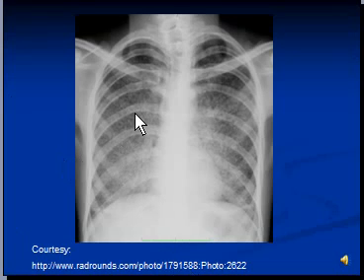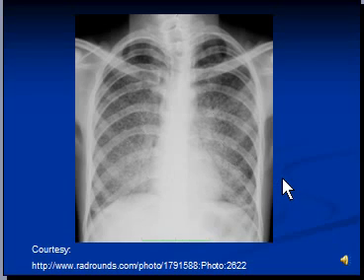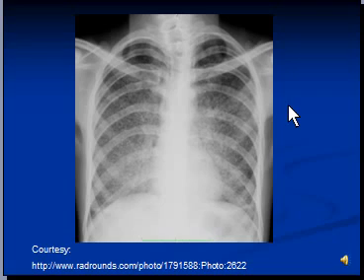The lungs are of normal volume, but the density is not normal. What we are seeing here are countless small nodules that are scattered evenly throughout both lungs. The X-ray is a very classical picture of miliary tuberculosis.